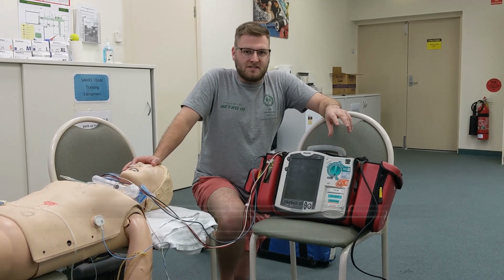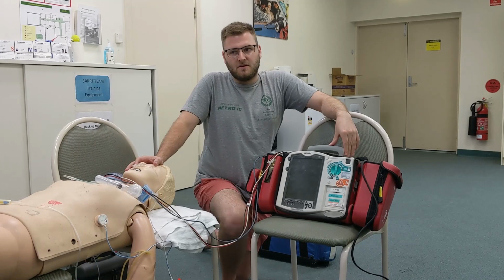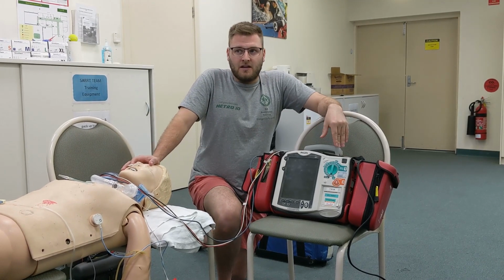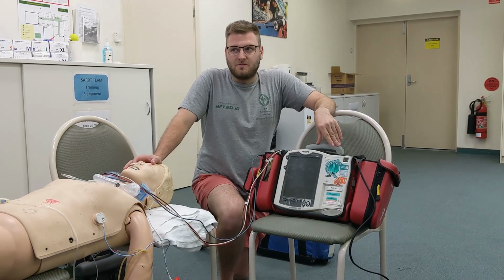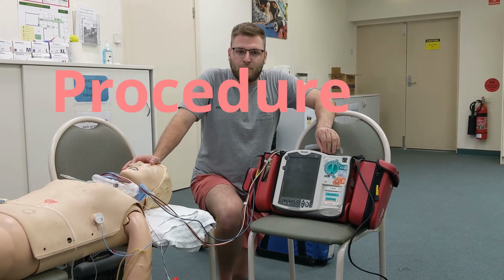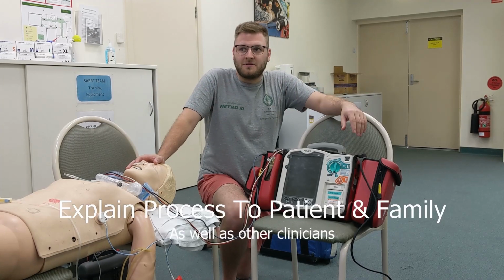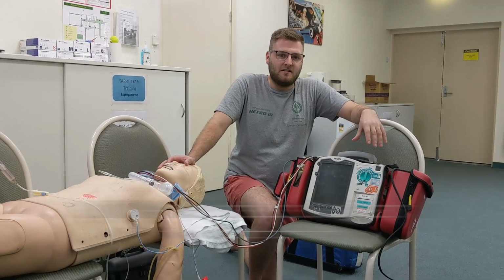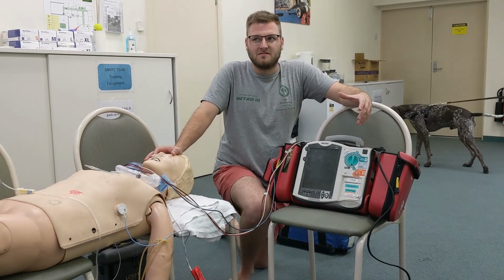And then we need to address any reversible causes that may be contributing to the patient's dysrhythmia that is possible to be addressed in the pre-hospital setting. If the patient continues to be symptomatic of the tachydysrhythmia, then we're going to have to move to synchronized cardioversion. Prior to doing that, we're going to need to explain what we're going to do to the patient, and procedural sedation may be required in order to undertake the procedure safely and without causing much pain or distress to the patient.